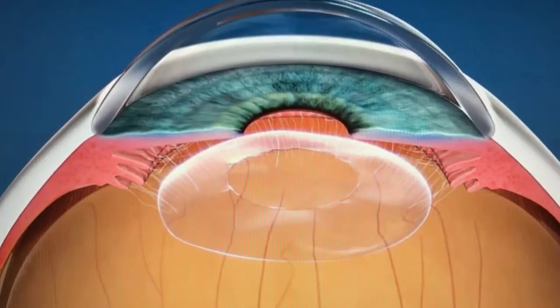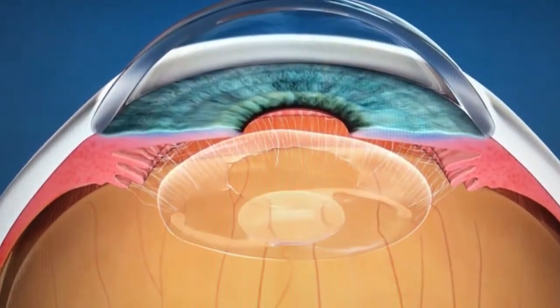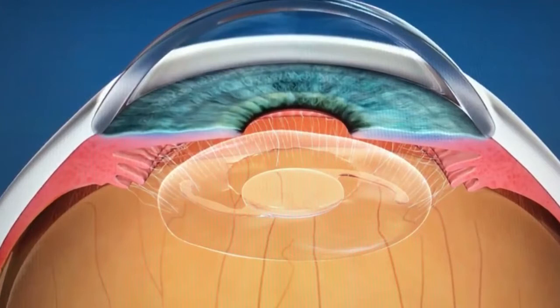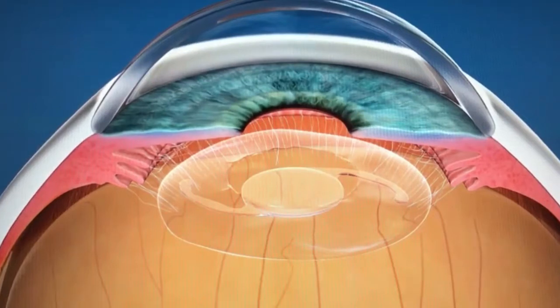To remove your cataract, a circular opening was made in the front of the capsule and a lens implant was placed in the same space. So the lens implant is sitting in the same capsule which once held your cataract. So even though the capsule is open in the front part of the lens implant, it is completely covering the back surface of the implant.